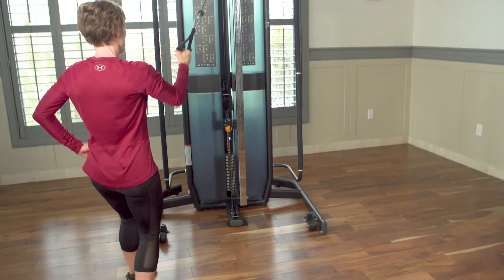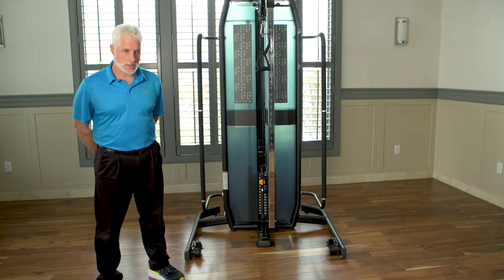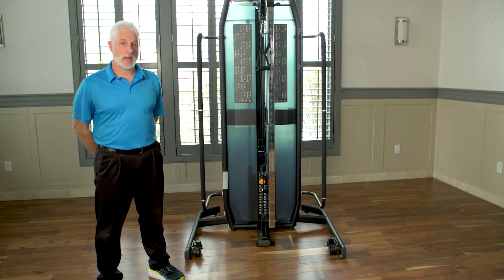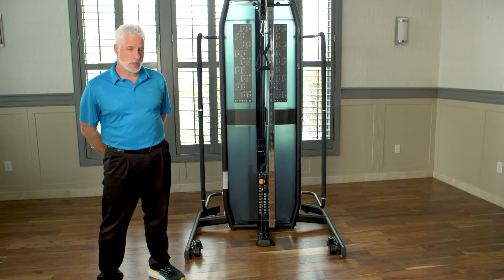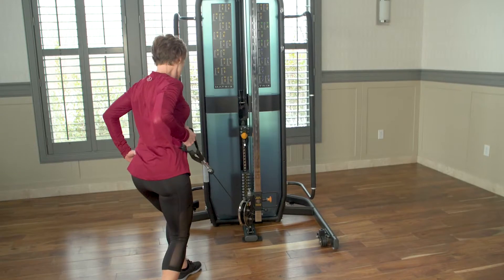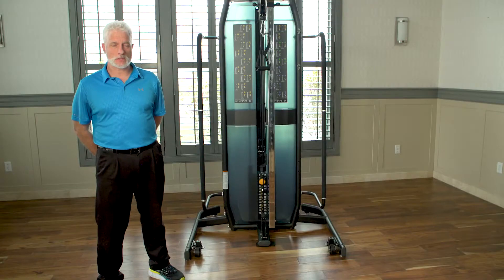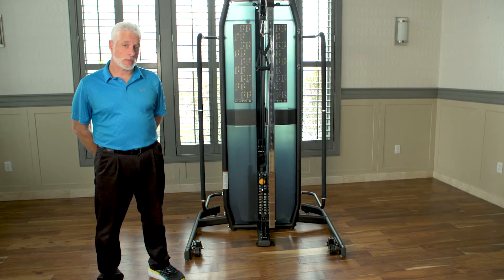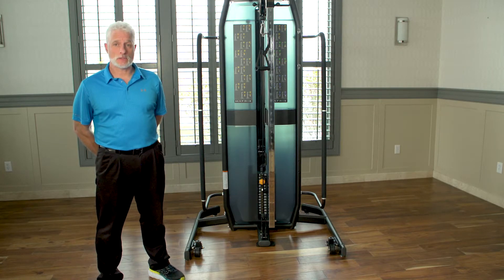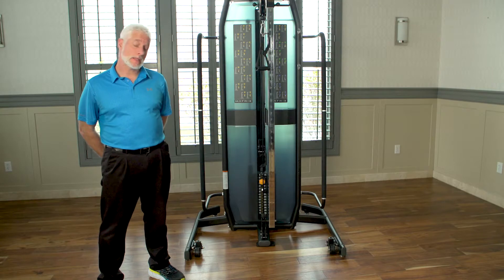As physical therapists, we want to work with our post-surgical patients and do a variety of different exercises. This machine, the adjustable pulley, provides you with the ability to do that while you're working on strength and endurance. You can also work on various positions as well as challenge their balance system and neurophysiological system while they're working on their Upper Extremity. Even though they are working on their Upper Extremity, you can challenge them and work on endurance, strength, and core stability for post-surgical rehabilitation as well as preventing surgery as well.